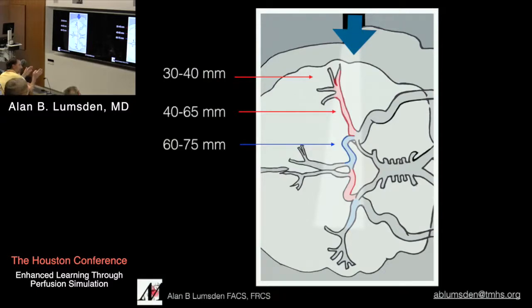And that stroke, is that being caused from those wires going up there in TAVR, or is that the one at the valve? Good question. How are you going to figure that out? Can't do. So we're going to put the wire up, get an MR. Basically, put the valve in, get an MR. That's the problem. The problem is it's incompetent. That's why we are wedded with TCD.